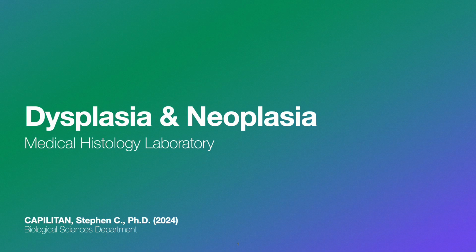This leads to a population of cells that are structurally abnormal, having a high nuclear to cytoplasmic ratio with large nuclei containing abundant dark staining chromatin and prominent, occasionally multiple nucleoli. These nuclear changes are associated with the evidence of incomplete maturation of the cytoplasm, which may be lacking in the specialized structures normally seen in that cell type, such as mucin vacuoles or surface cilia. This is called a failure of differentiation, and the cells are said to show atypia.